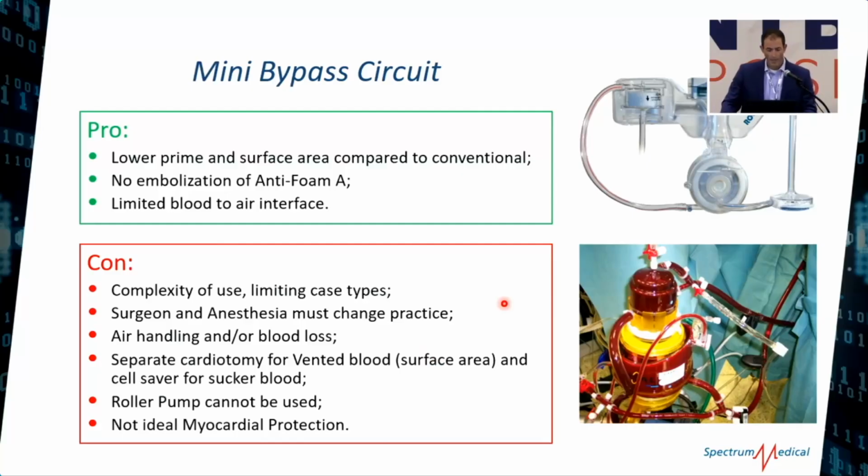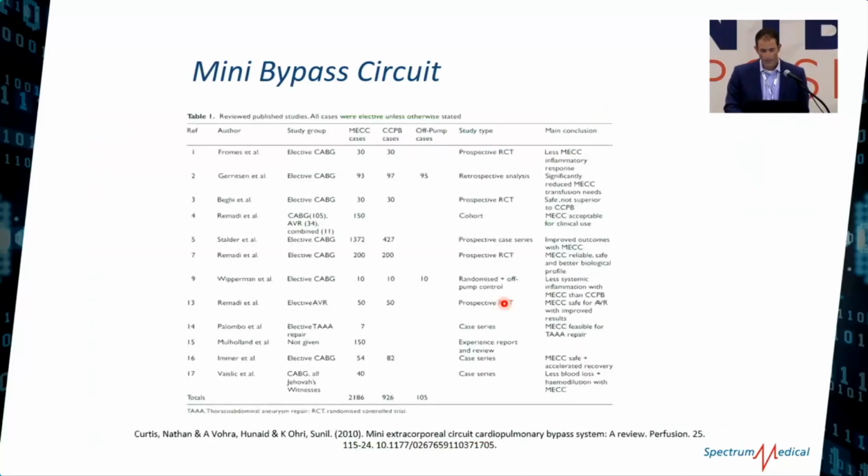There's separate cardiotomy for vented blood and cell saver for sucker blood. Roller pump can't be used, and it's not ideal for myocardial protection.